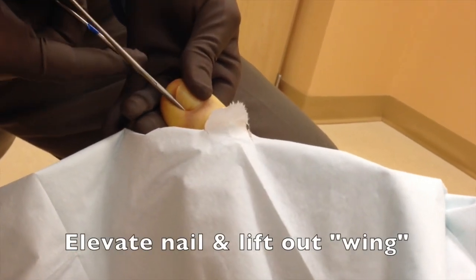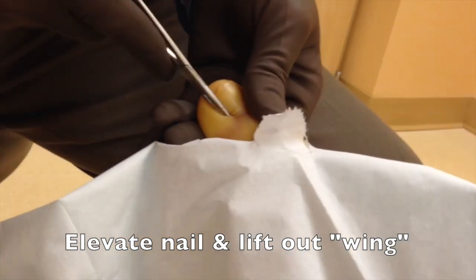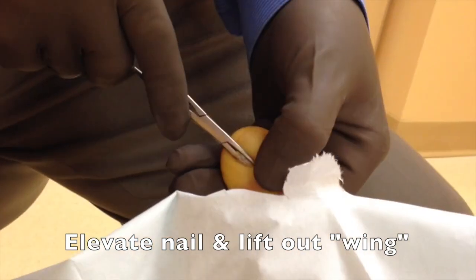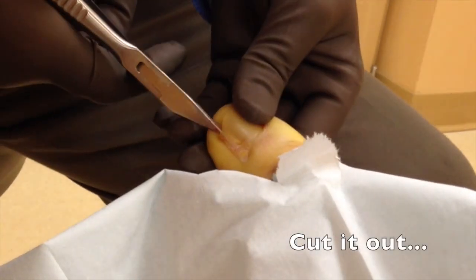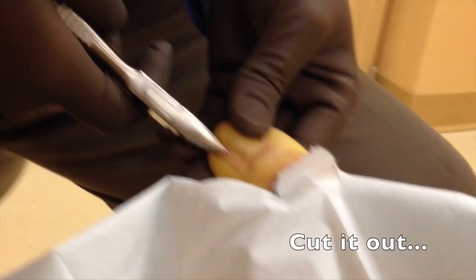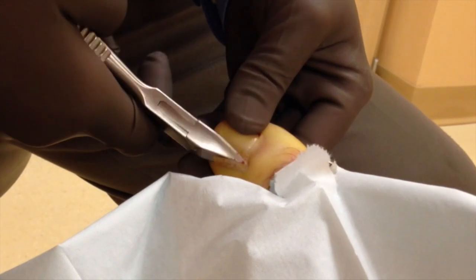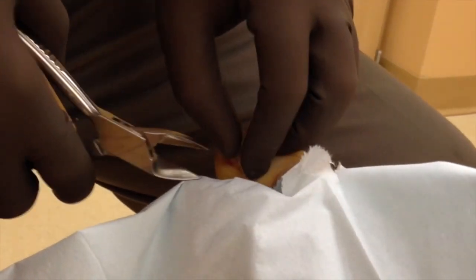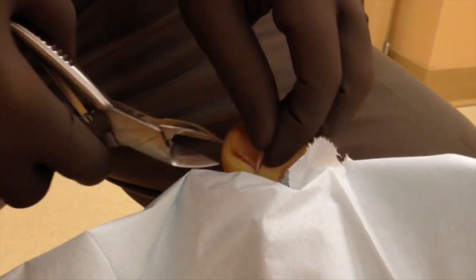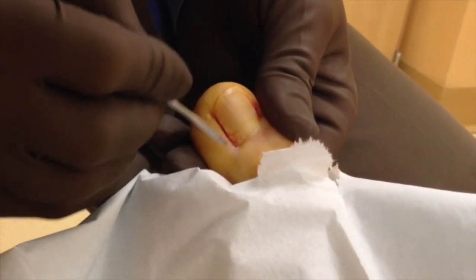For the other side, use the hemostat to elevate the nail, slide it all the way down to the nail bed, then clamp and lift out the wing. Cut parallel to the nail, staying close to the edge. Probe for fragments to confirm no nail shards remain.